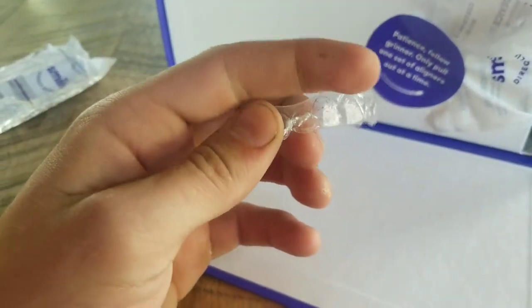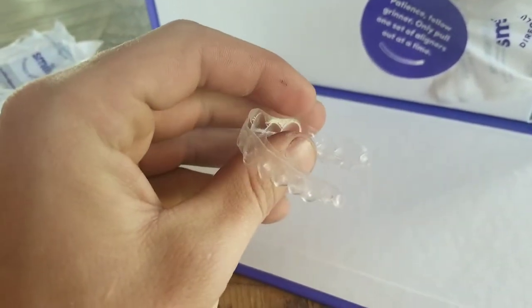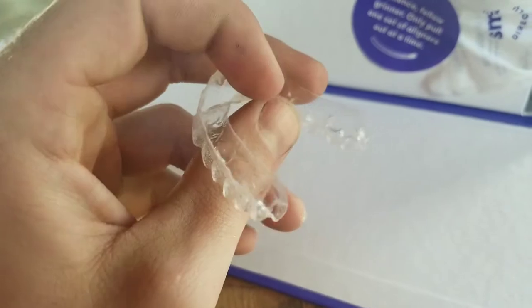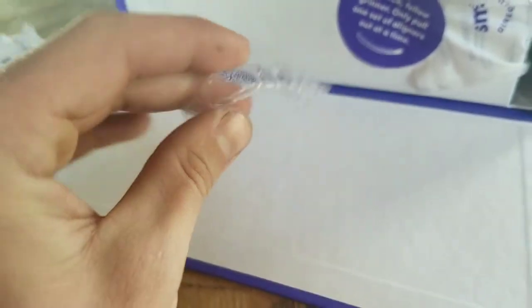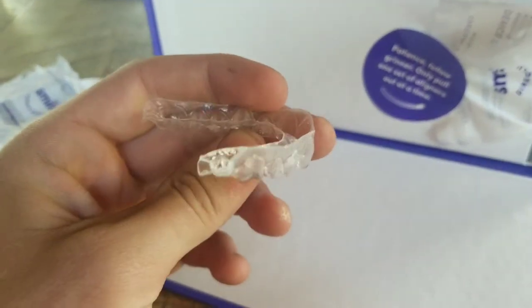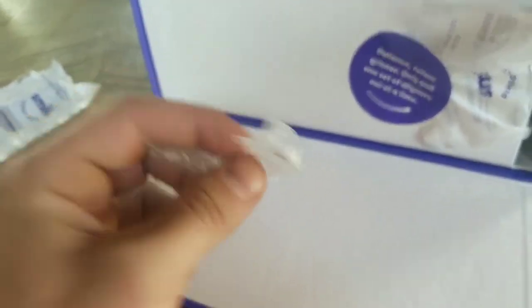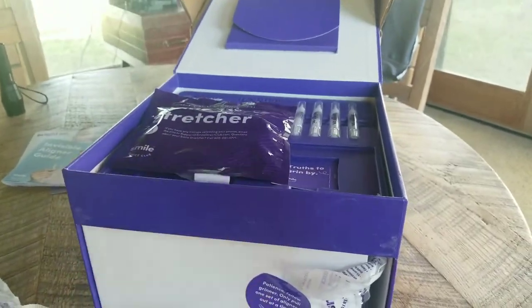Anyway, so this is what the top set looks like. They kind of cut it to your gum line — it's really not that bad once they're in. They're different for sure, and they kind of poke out a little bit. I feel like it's just something you're going to get used to. So this is what comes in your first Smile Direct box.